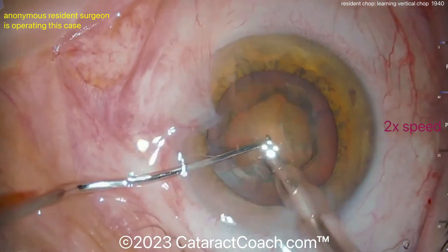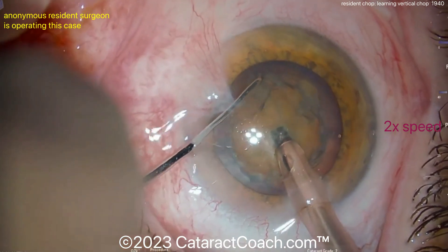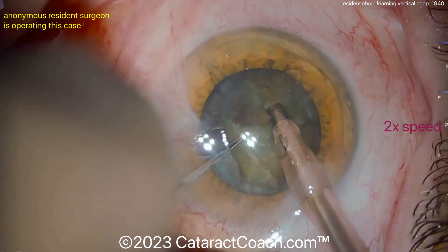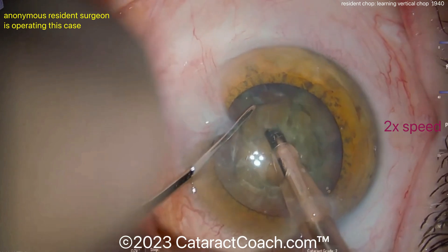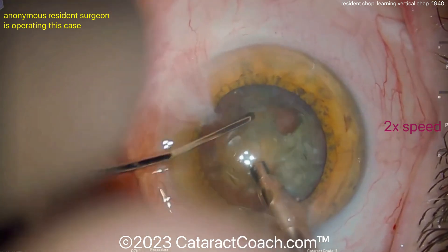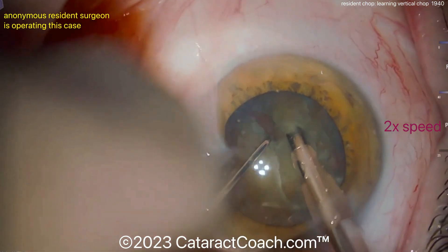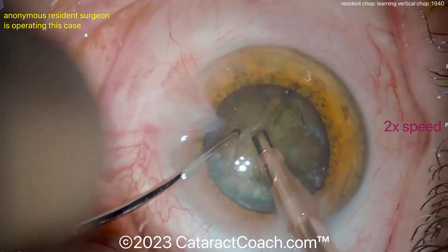Thinning up the anterior cortex. Here's a sharp chopper — that's a vertical style chopper. Buzzing with the phaco probe and the chopper going in vertically towards the optic nerve, and now split. Then split apart. Look where the phaco probe is though — that's not a great position. You want to place it more sub-incisionally, not in the center of the nucleus or distal to it. The two instruments — the chopper and the phaco tip — are very close together, so you're not getting great chops here.